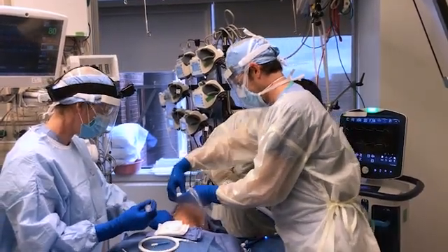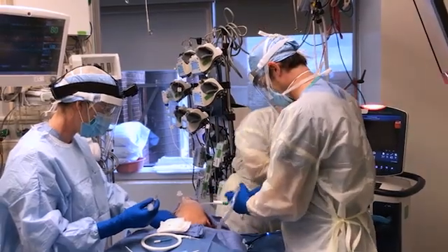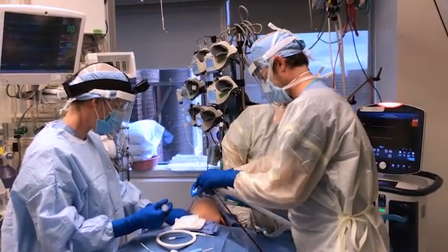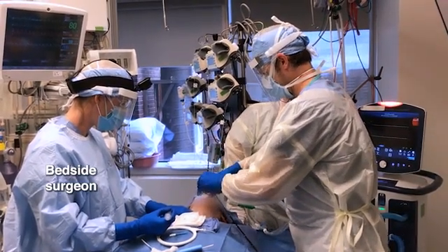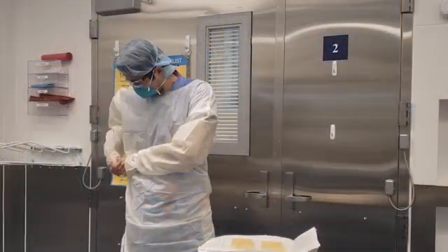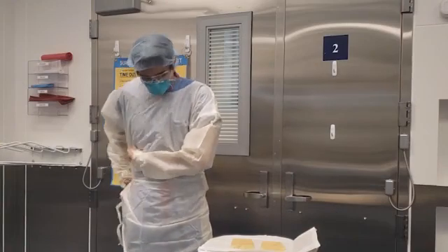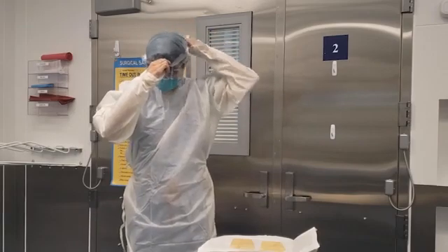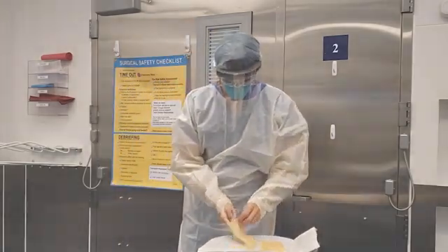Minimizing the exposure of healthcare personnel to aerosol-generating procedures is critical when treating patients with COVID-19. To safely perform percutaneous tracheostomy, a minimum of three people must be present—the bedside surgeon, a bronchoscopist, and a respiratory therapist. Percutaneous tracheostomy is considered to be an aerosol-generating procedure. All persons in the room must be wearing PPE, following your institution's policies regarding appropriate PPE during aerosol-generating procedures.